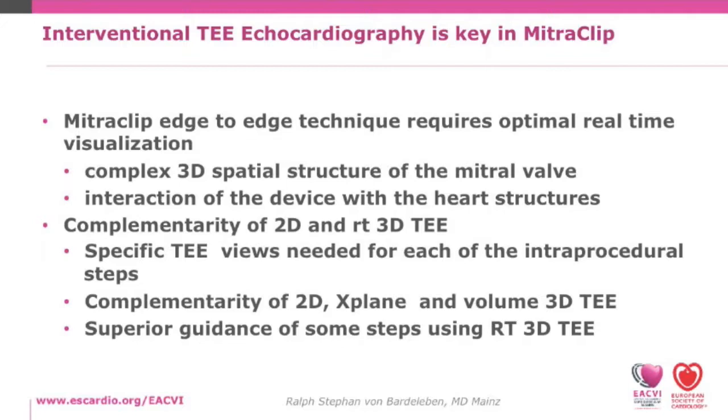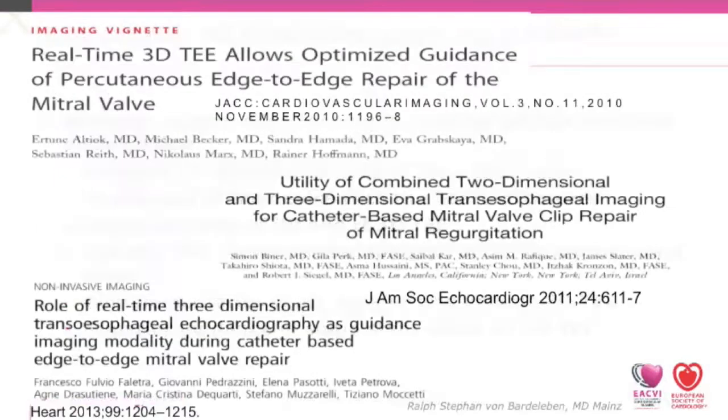We restrict ourselves to two-dimensional echo, and sometimes we want to see the extent of the disease, where we use the two different forms of three-dimensional echo, which is X-plane, biplane, or triplane imaging, depending on the vendor, and full volume 3D TE. There's a superior guidance of some interventional steps using real-time three-dimensional echo.